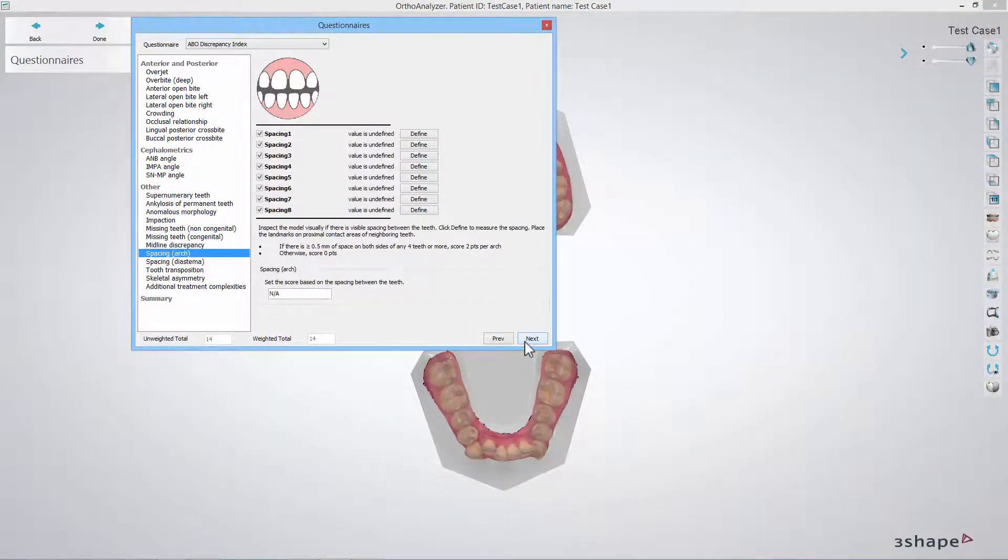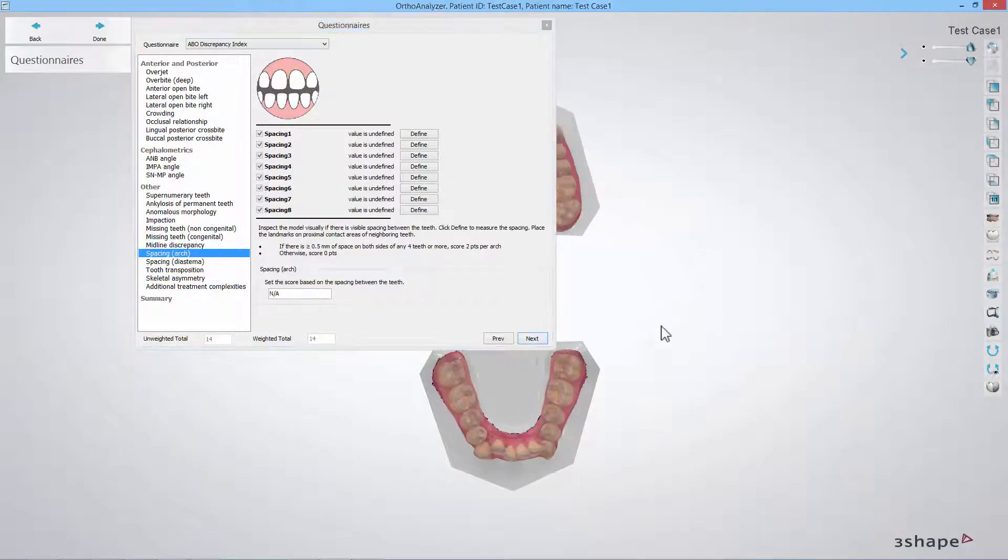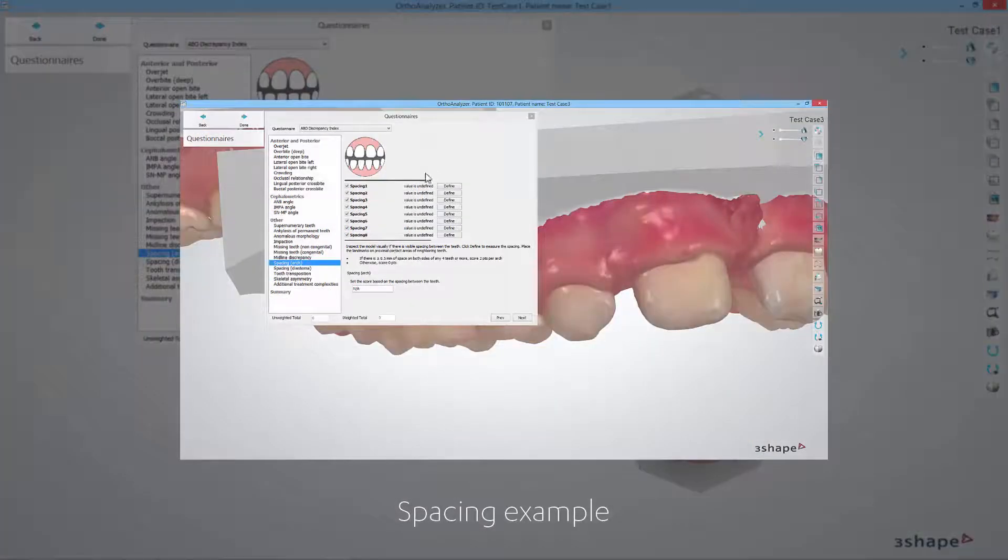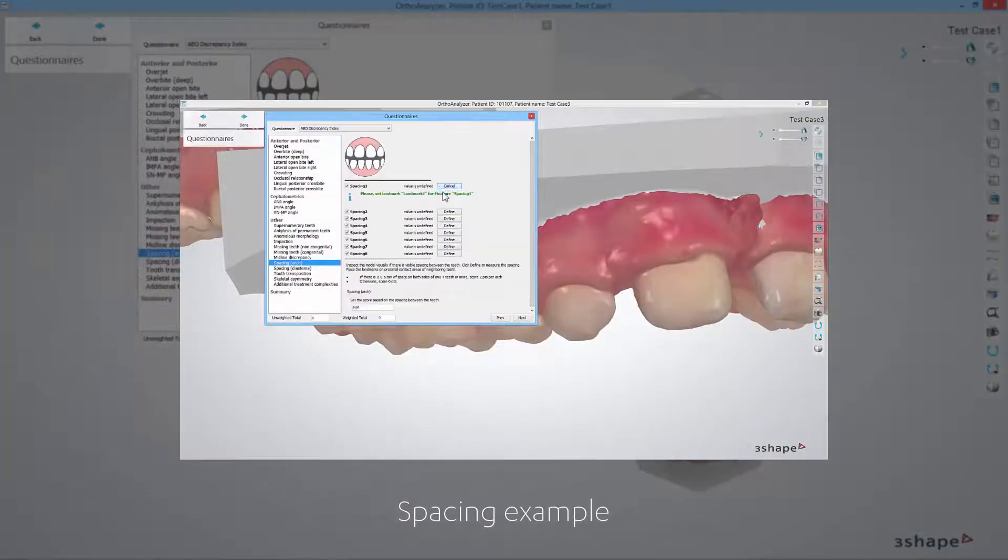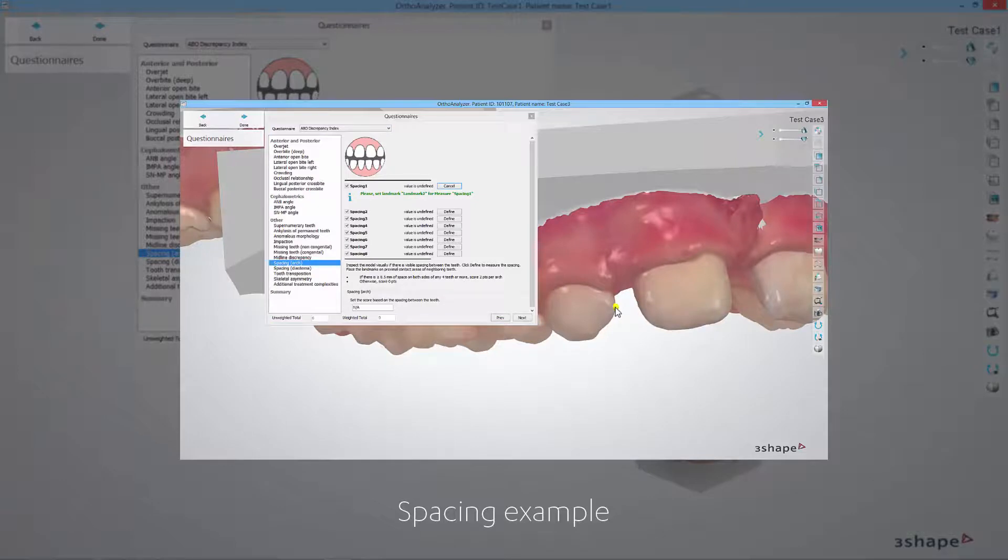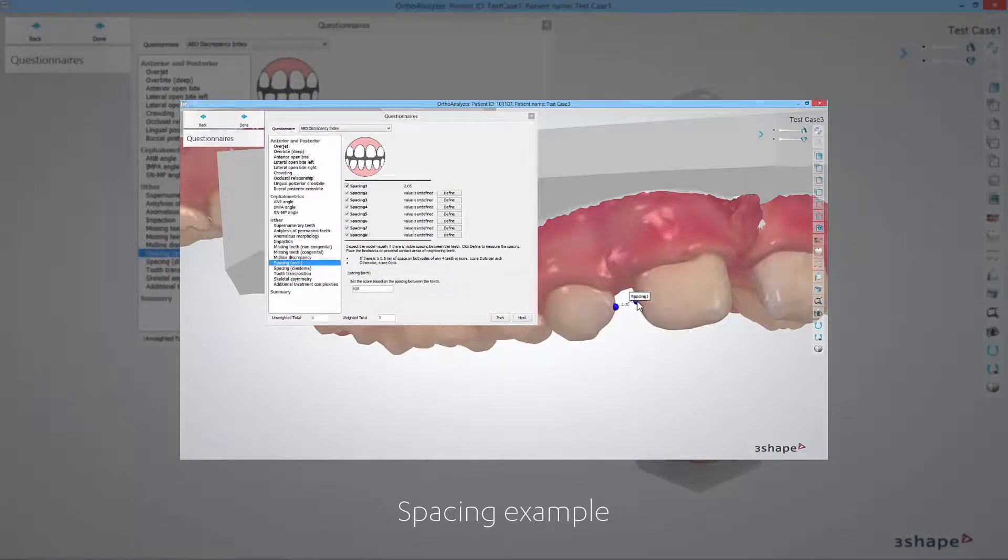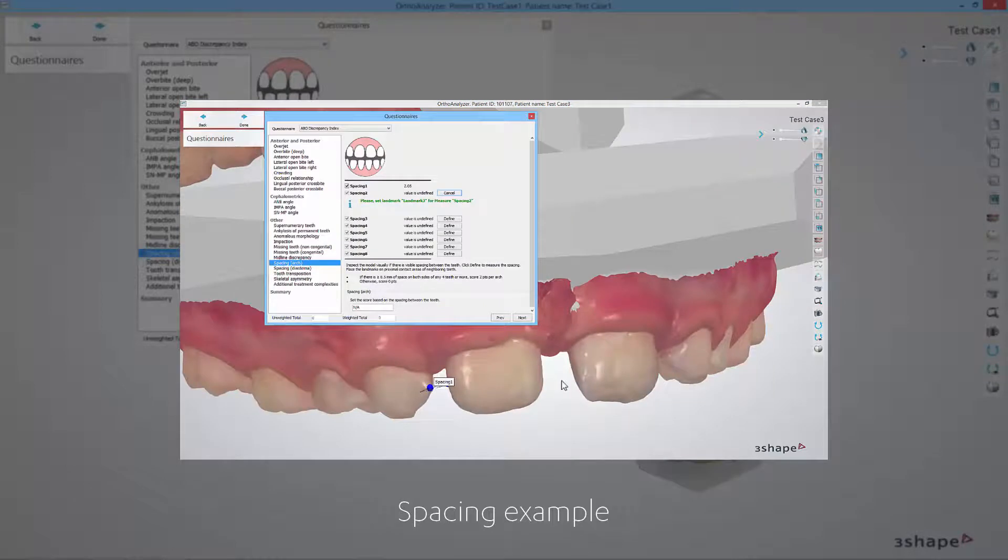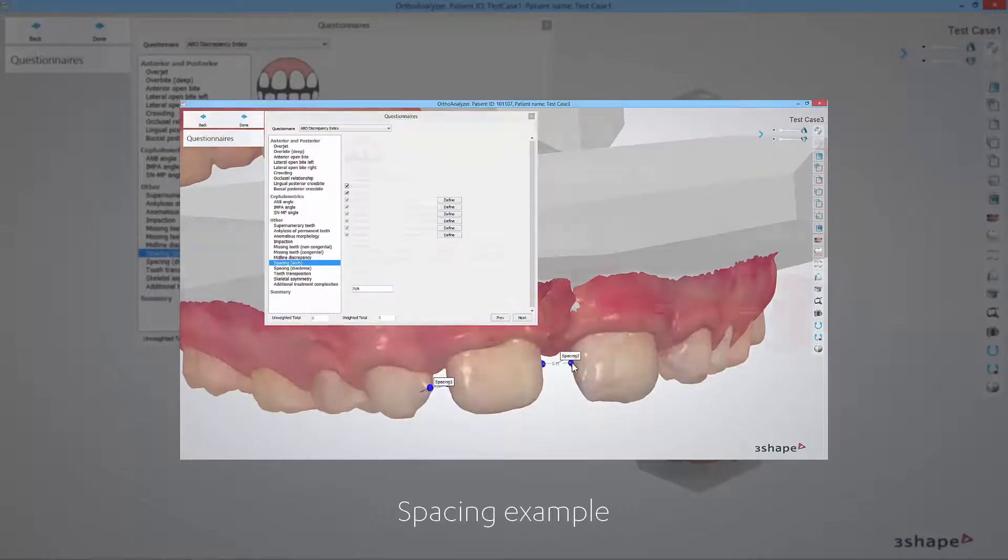In the spacing arch step you should inspect the model visually. In cases where there is spacing between the two teeth, click the define button and place two landmarks to measure the space between them. Do the same for the other spaces on the model and fill in the result accordingly.